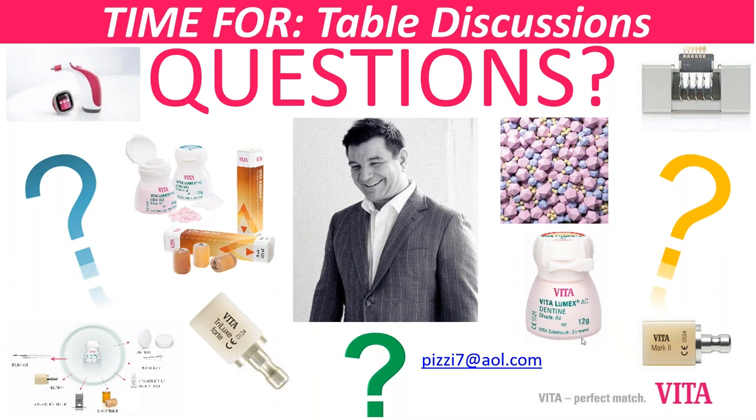Yeah, you kind of answered the follow up question to that, which was, if you do open the bite, what's generally comfortable. And I think you just mentioned 1 to 3 millimeters sometimes. But again, I'm sure it depends on what the patient can tolerate and the case design, treatment planning, and so forth.